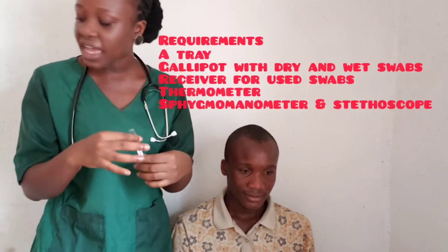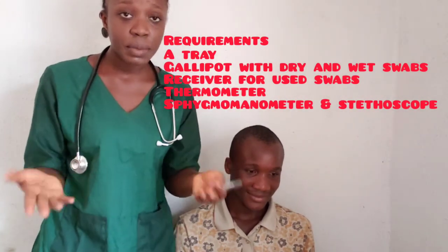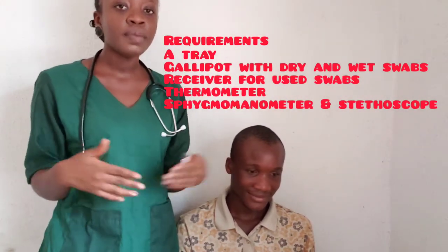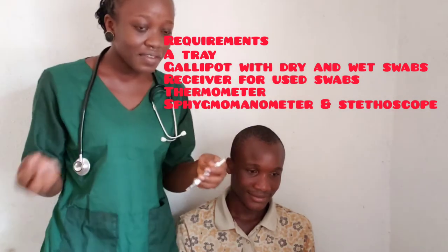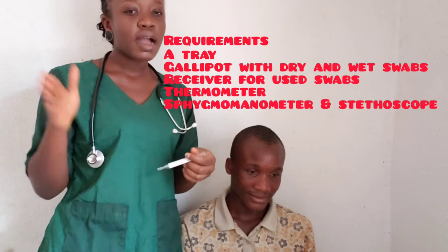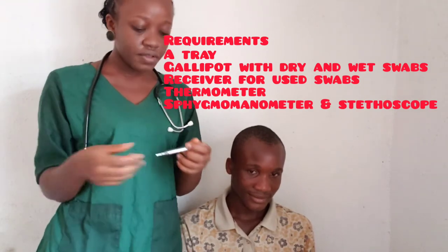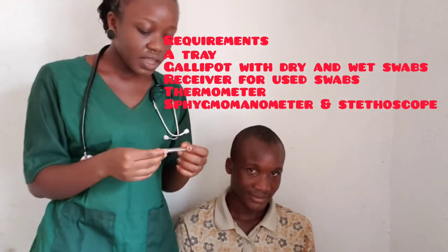I have my equipment with me, which are the kidney dish, the wet swab, the dry swab, the thermometer, the blood pressure apparatus — that is, the sphygmomanometer — and a receiver. Those are the basic things you should have as your equipment. I will display it on the screen for you to see the basic equipment you need for vital signs.